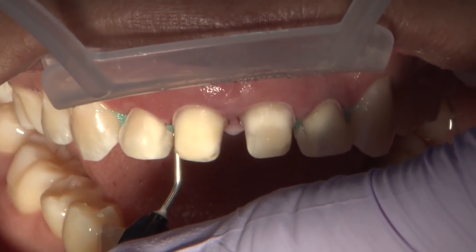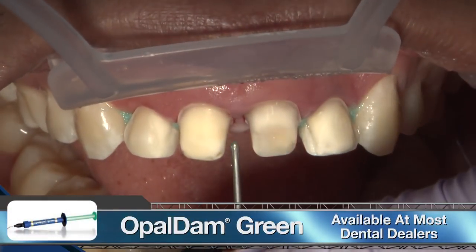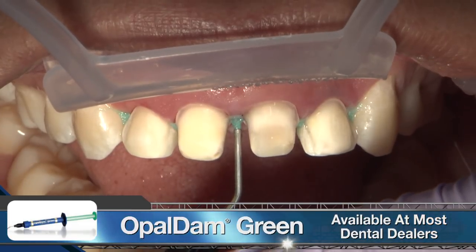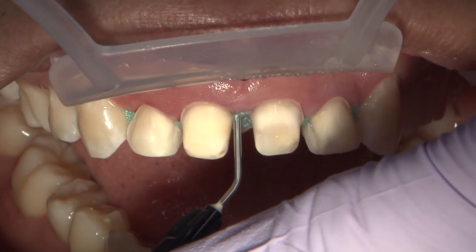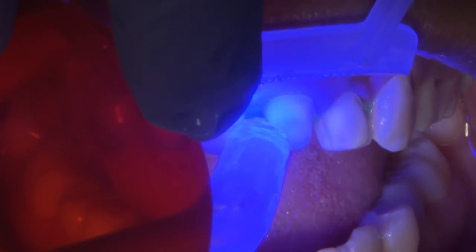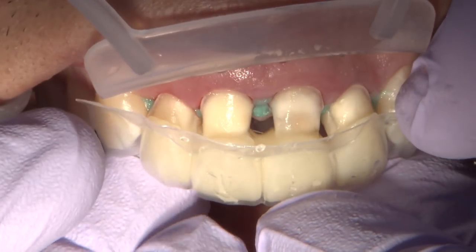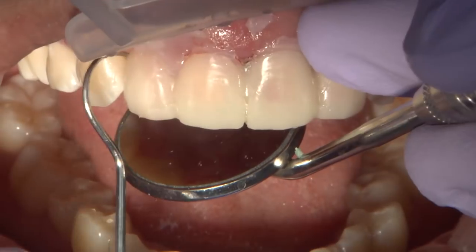Moving right along to a slightly less straightforward case, this patient has deep interproximal sulcus and areas distal to the lateral incisors that could cause reline material to flow and lock the temporary into place. During instances such as this, I like to take an additional step and place flowable blockout resin to the areas that may cause unnecessary hang-ups. A quick light cure, smear layer placement, and the Fast Stent nested BioTemps can be placed for the reline cure process.